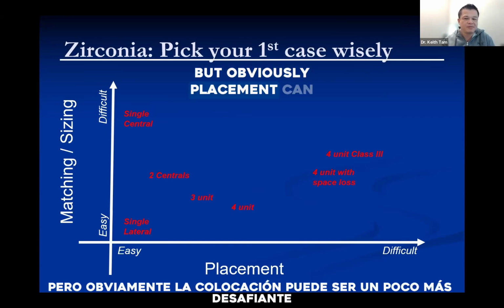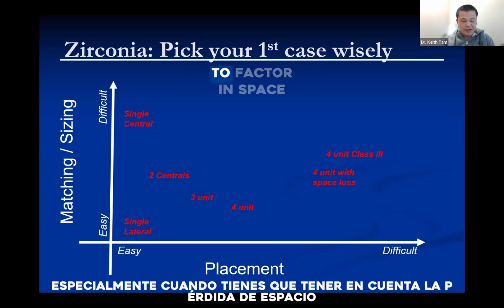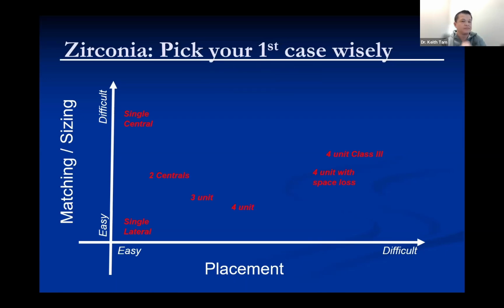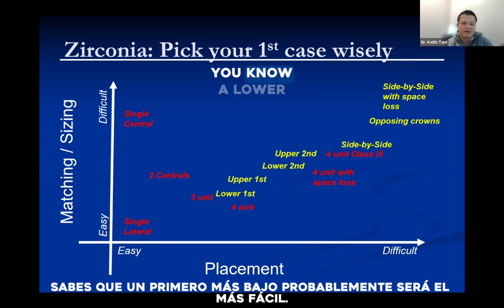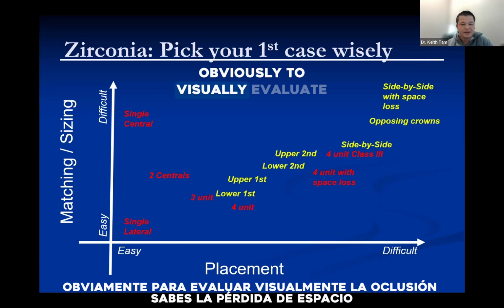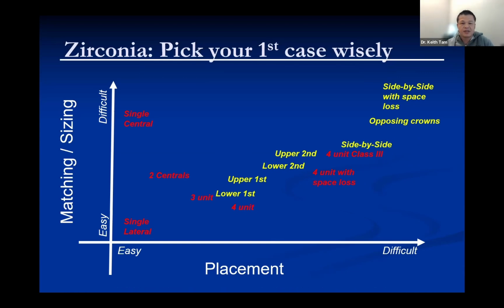But obviously placement can be a little more challenging, especially when you have to factor in space loss. And then when you get into posterior teeth, a lower first molar is probably going to be the easiest thing, obviously, to visually evaluate occlusion, space loss, adequate circumferential reduction, those types of things.